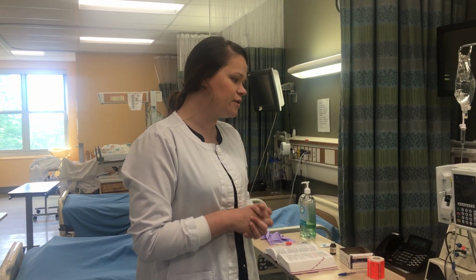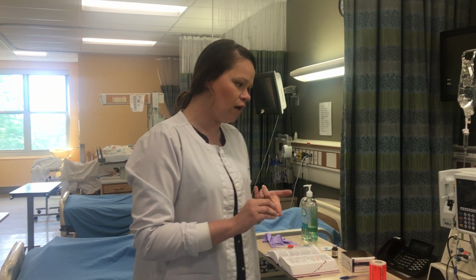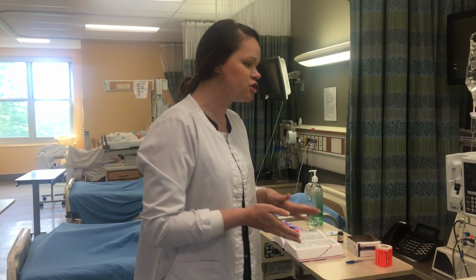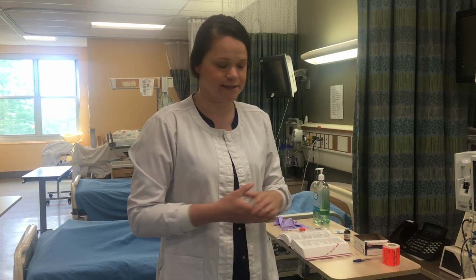So the first thing that we would do is our 6 rights of medication administration. We would also make sure that the medication that we're going to administer does not interact with any of the medications the patient is on, and of course the patient allergies. So we have done all of those things, and we're going to move on to preparing for the administration of the medication. The medication example that I have today is IV Furosemide or Lasix.